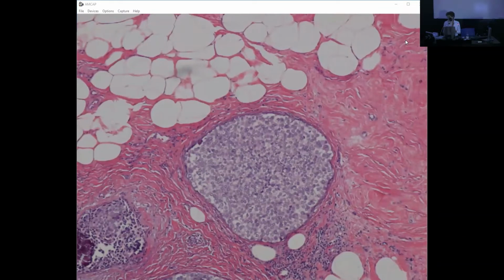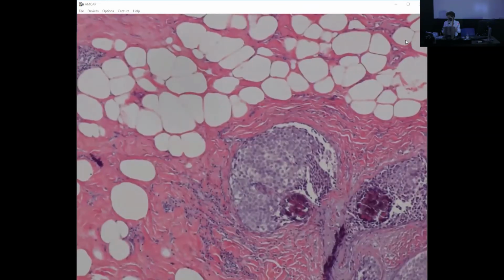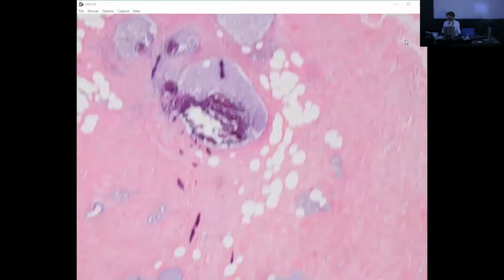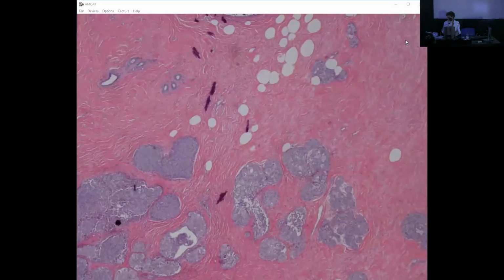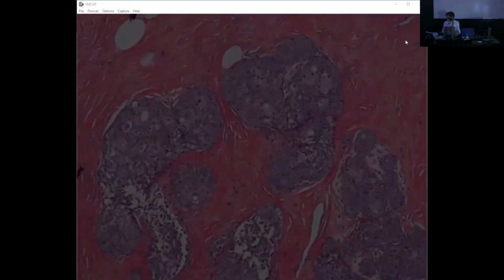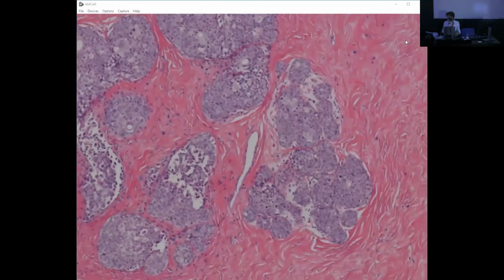And I've seen a number of cases that were diagnosed as DCIS, solid type, low nuclear grade. So there is a decision when you find a solid proliferation like this that is solid throughout. If you have any questions, do the immunohistochemical stains for E-cadherin.